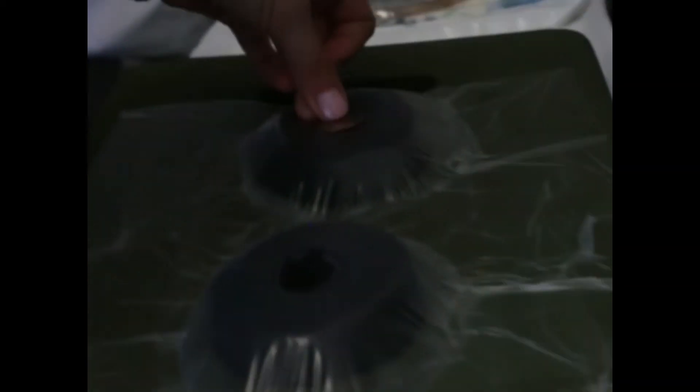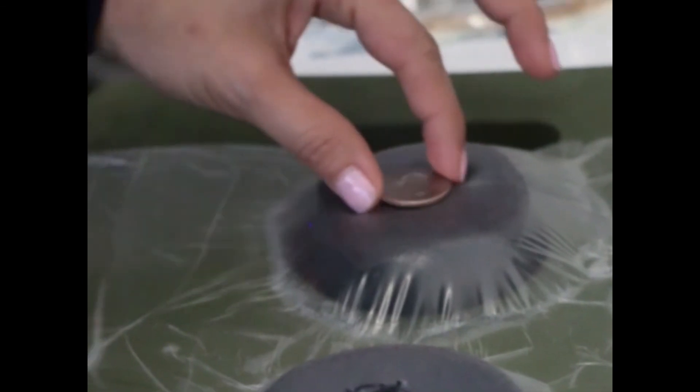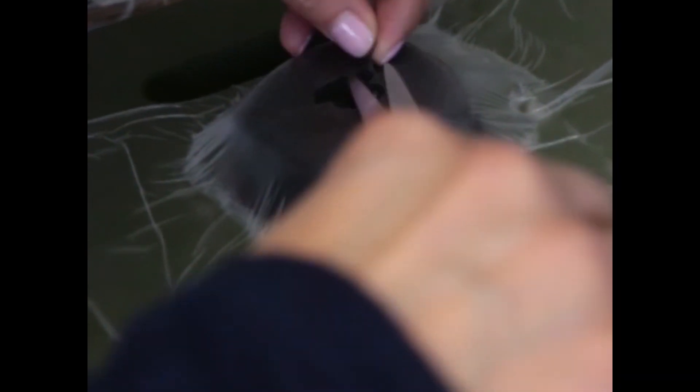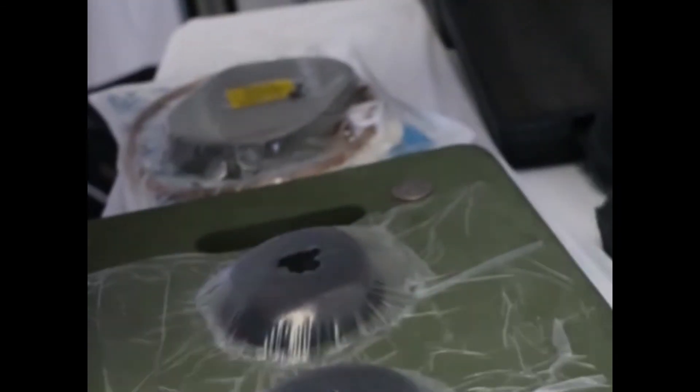You can use, as long as it says clean, the minimum amount of the size of a quarter. So you can go a little bit over. You're just going to pinch it up. You're going to cut. You're going to cut it off. Cut yourself. Just go around. It's okay, we cut this much. What I'm saying is, when they're in, I'm just going to cut this off. There you go. There you go. Does it have to be really, really neat? No, it doesn't. As long as it covers the entire perimeter of the suction sensor? Yeah. It covers it, which is this right here. Wonderful. That's it.